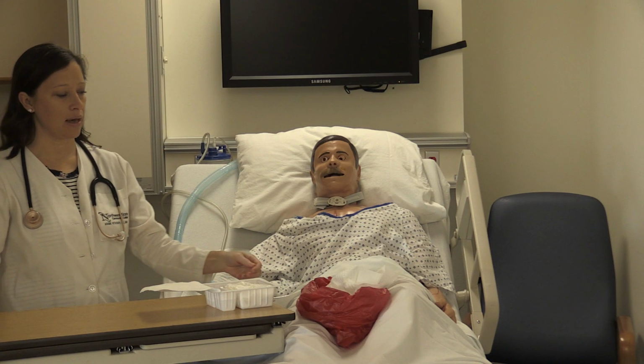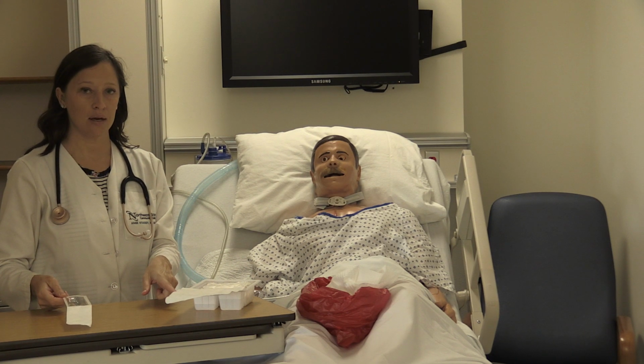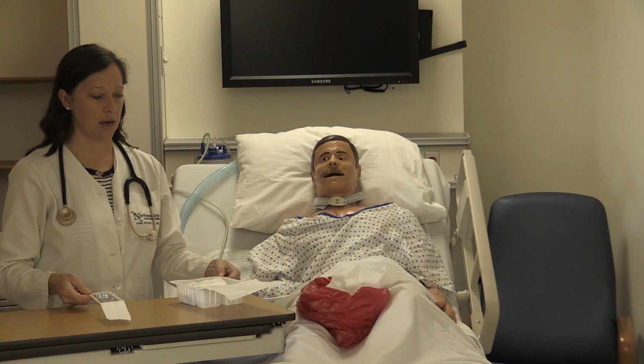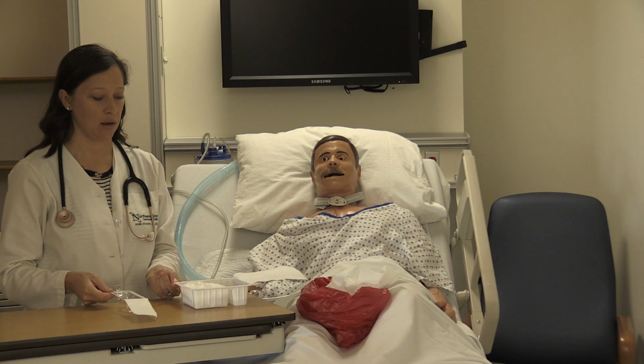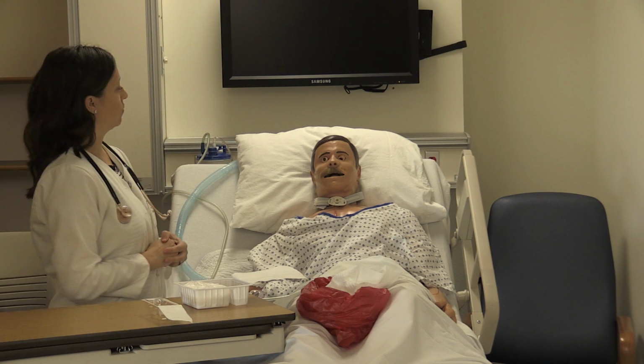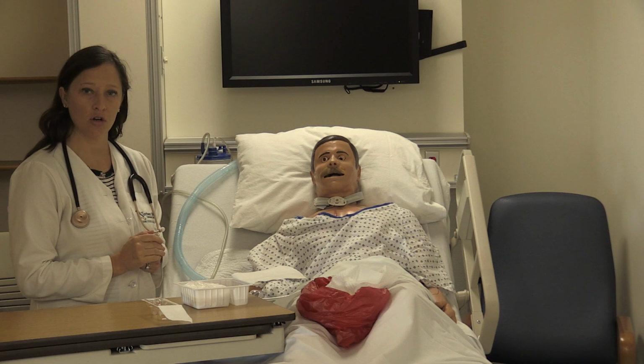So now I need to get my kit here that I need. I'm not going to use this side of the saline that I used for suction. I want to use the other side here. And again, I can touch the outer edges of this. So, okay, Mr. Smith, we're going to go ahead and I'm going to don some more sterile gloves.